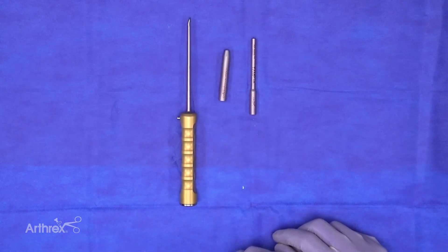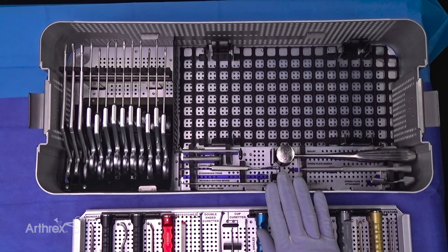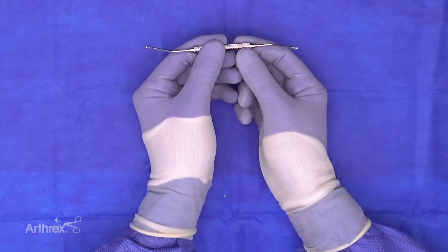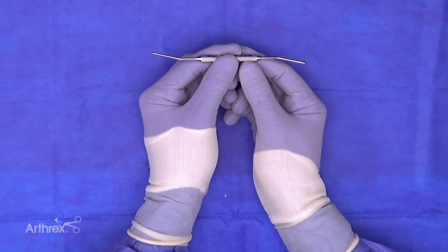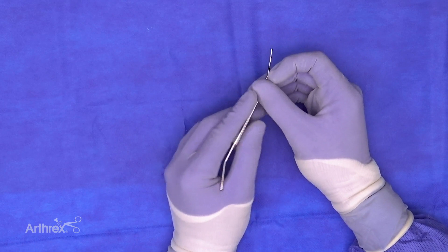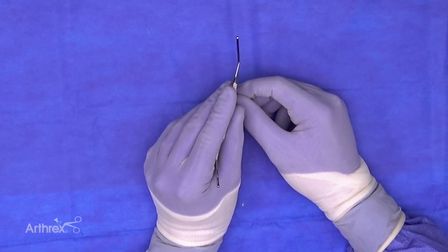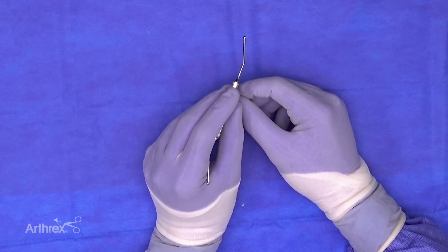On the right side of the second tier is the syndesmosis probe — not a new instrument, but based on what Dr. Guyton published and helped design. It has a 2mm end and a 3mm end that the surgeon inserts between the tibia and fibula arthroscopically to determine the severity of the syndesmotic injury.